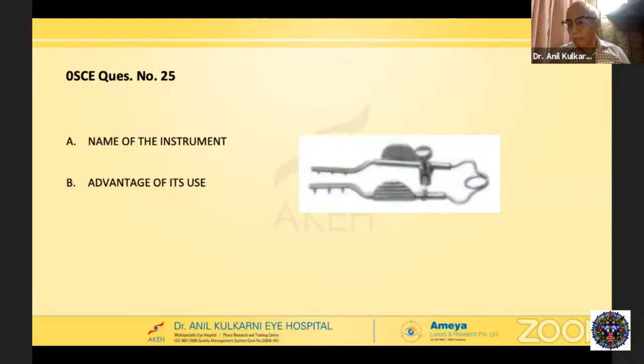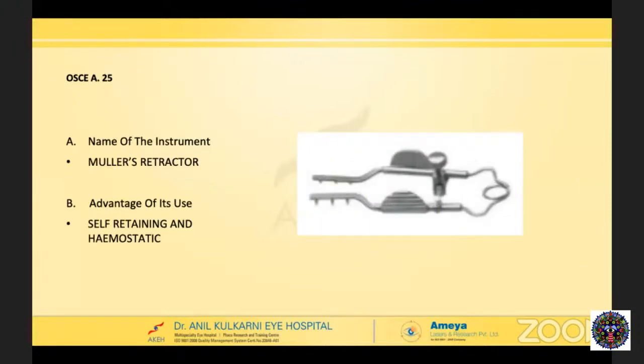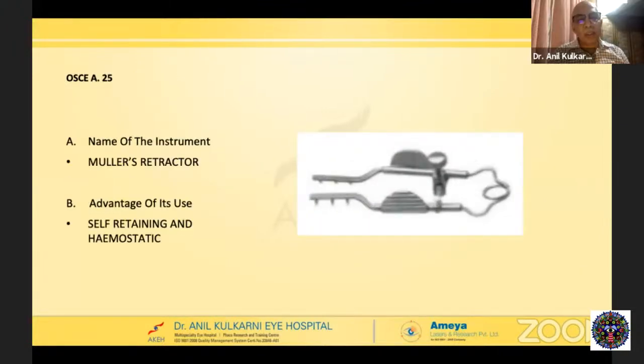25. The name of the instrument is Mueller's self-retaining retractor.